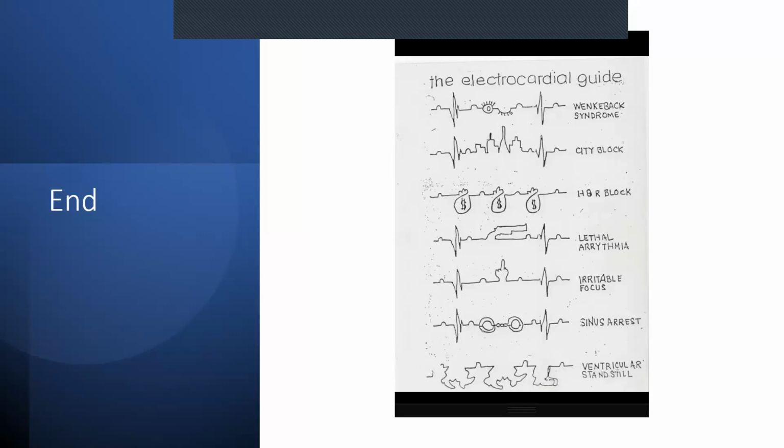There could be other things. She could have carotid stenosis, she could have aortic stenosis, there's lots of other things, but the fact that there is a premature ventricular contraction means that there's something going on. She needs further investigation. Would you send her home? No. You'd call the physician and you make a decision. Okay, that's basically it. Right. Any questions?